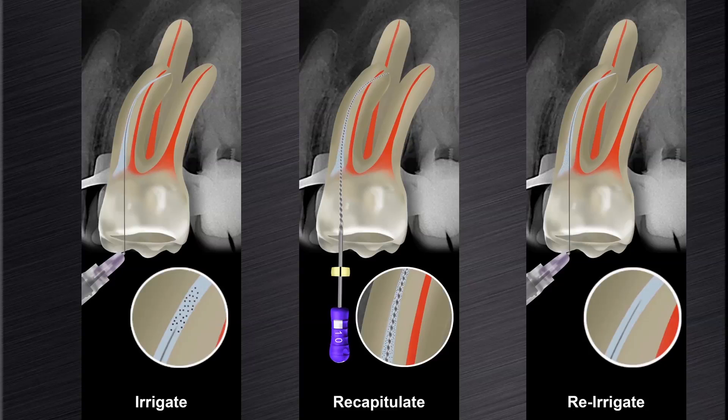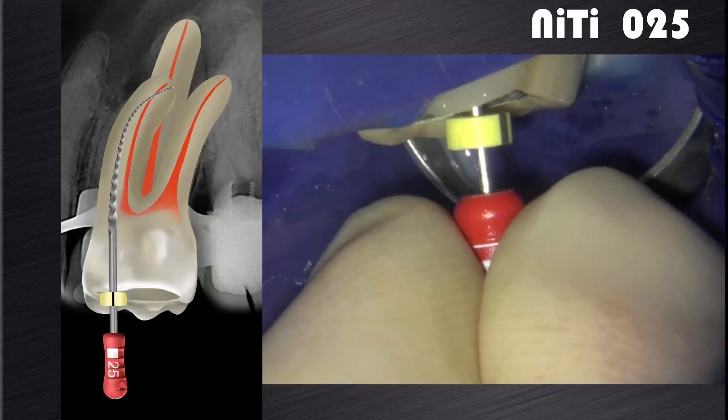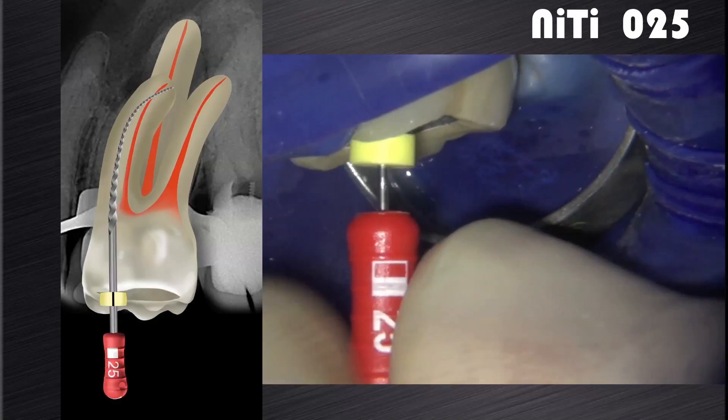Again, irrigate, recapitulate, and re-irrigate the canal to remove cutting debris. The next step is to gauge the foramen with a size 25 NiTi hand file. If the file is snug at length, the canal is shaped and ready for final disinfection.